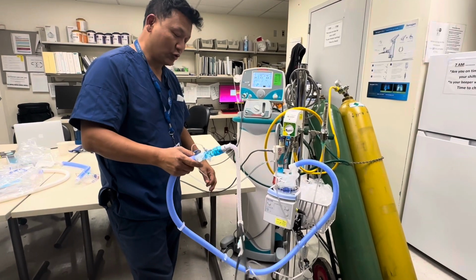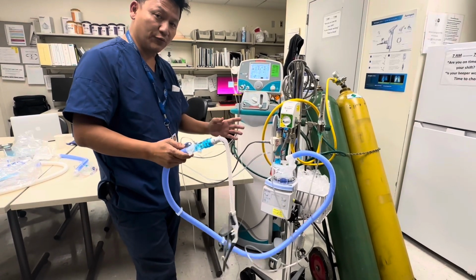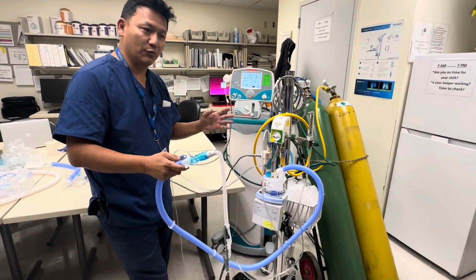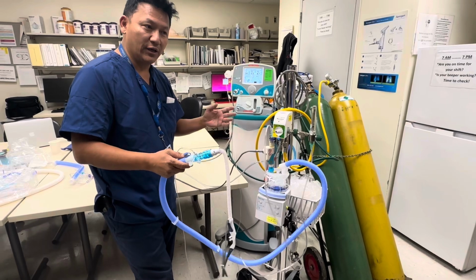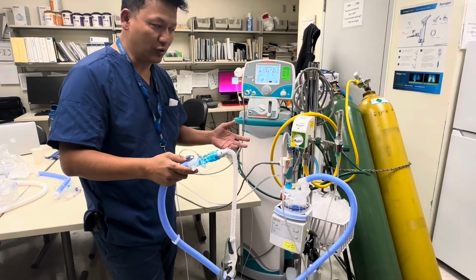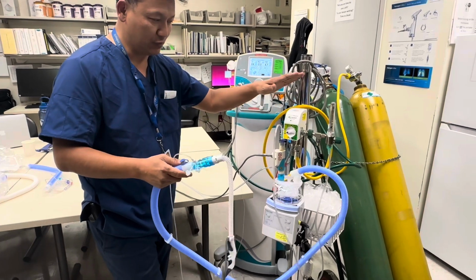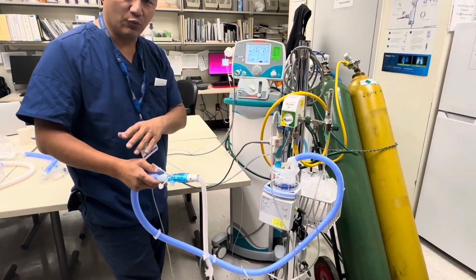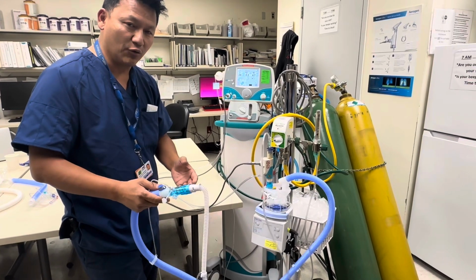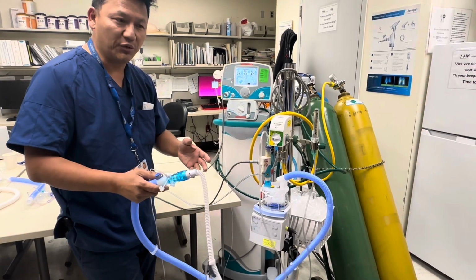Good. Okay, so first of all, we're doing a nitric oxide. When the doctor's asking for nitric oxide through nasal cannula, there's only 2 ways to do it. One is the blender. One is the HiFlow, we thought that we could do it through HiFlow, but for some reason, we couldn't do it.